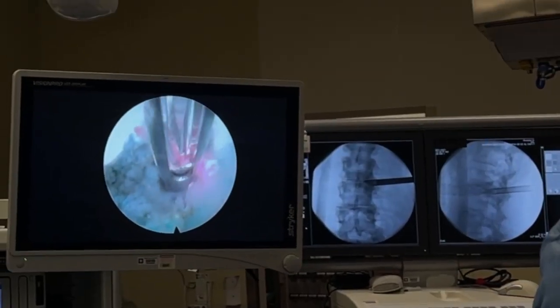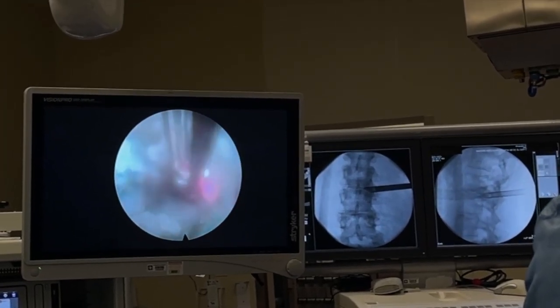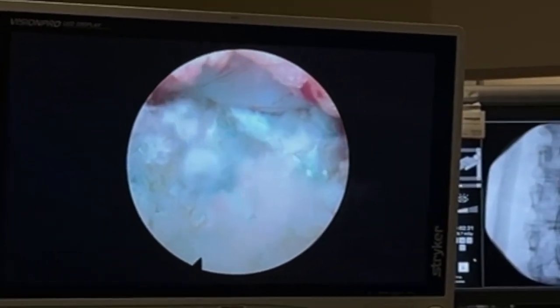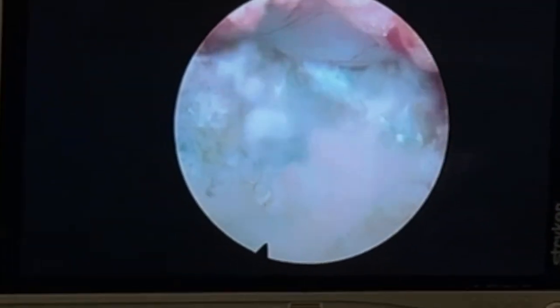Using the laser to reduce this down. I don't know how people don't use the laser for this surgery. It's so much more fun. All right, look how cool this is. You can see the dural tube right there. Watch, it'll start pulsating if I stop moving. Look at that. How cool is that?